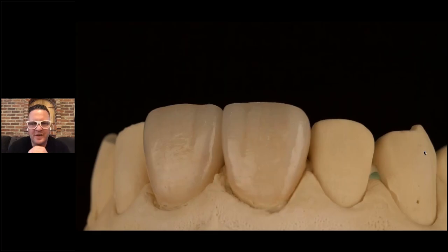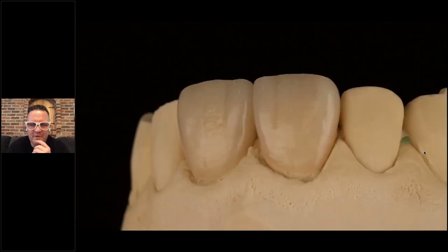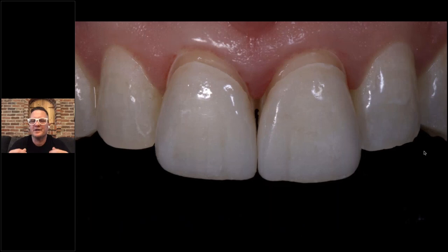I think I pressed this out of a B1 again, the MT-B1, since I'm usually working with the MTs. Here's a couple of the lab shots. And then here's him doing the glory shot that dentists do sometimes, where the restoration is being inserted but isn't quite there yet.